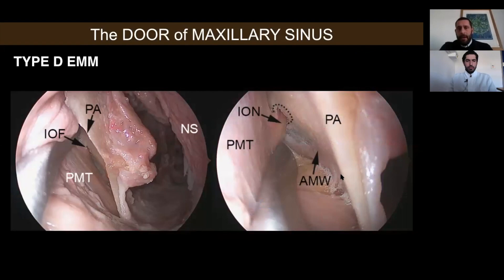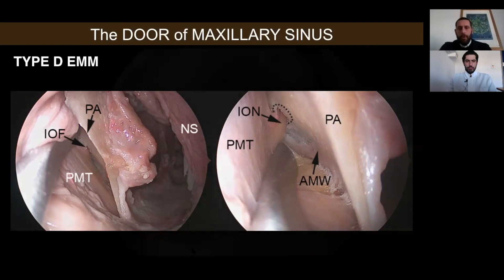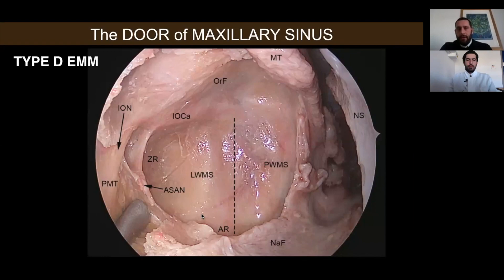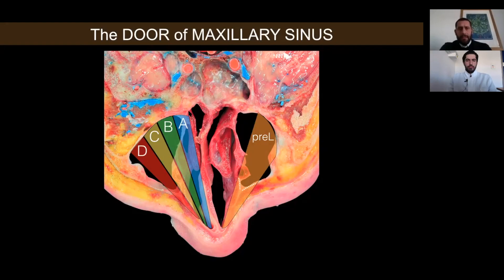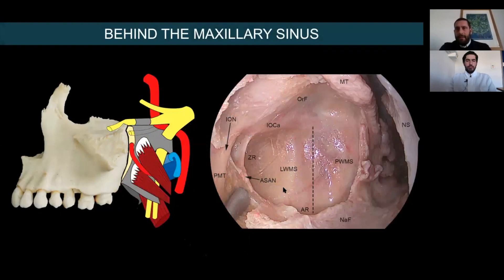If you need more space, you can also remove part of the pyriform aperture and the anterior wall of the maxillary sinus. Your landmark at this step is the infraorbital nerve in the anterior wall. You can remove the bone of the anterior wall — this is the infraorbital nerve. You see how nicely the right maxillary sinus appears with a zero-degree endoscope after this procedure. With this modular approach, you can progressively expose far lateral areas towards the skull base, because the areas to reach are behind the posterior wall of the maxillary sinus.